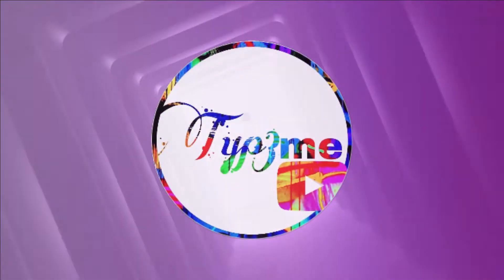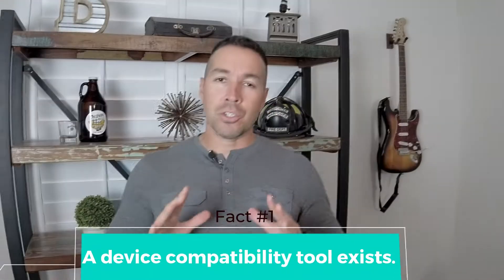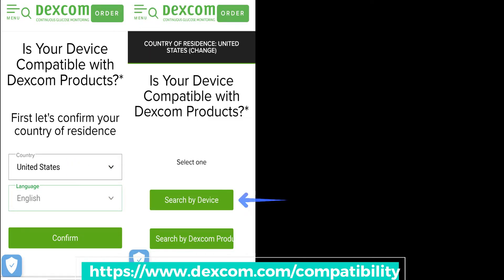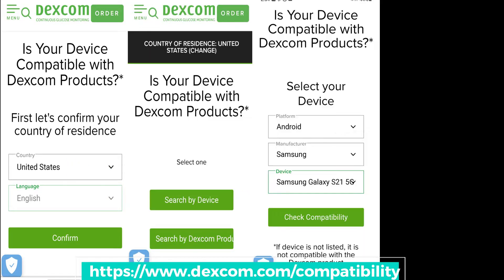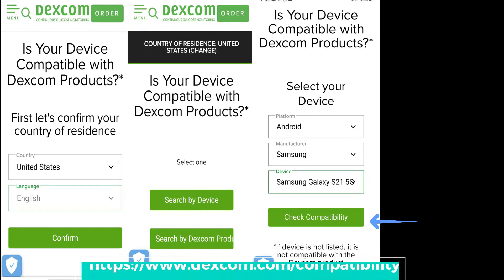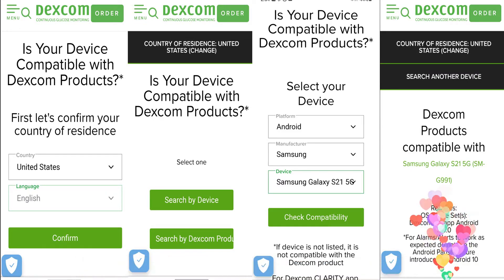Round one. Before you buy, you should make sure to check your device compatibility. In order to do so, go to this link. Select country and then language and then click confirm. Click search by devices, select your platform, whether it be iOS or Android. Look for the manufacturer, select the device, and then click check for compatibility and you're all set.